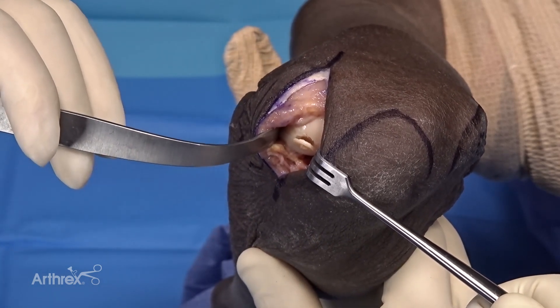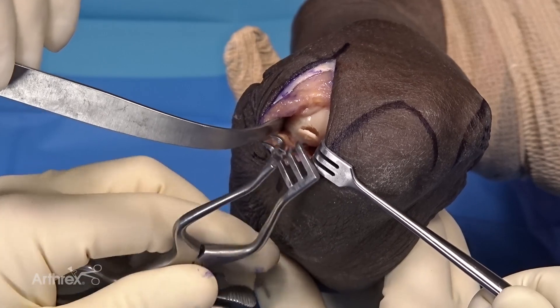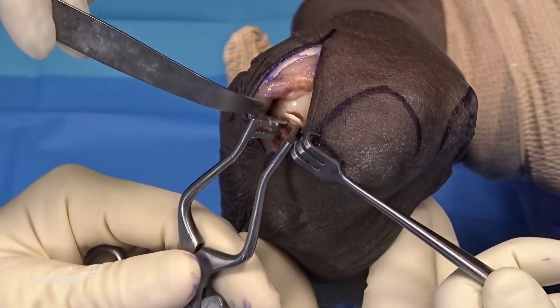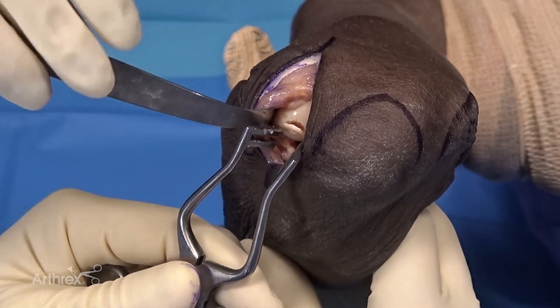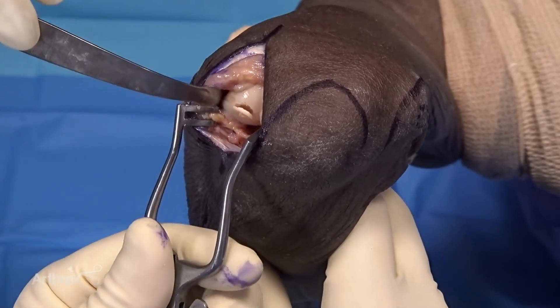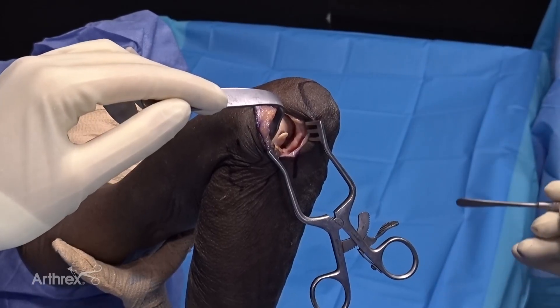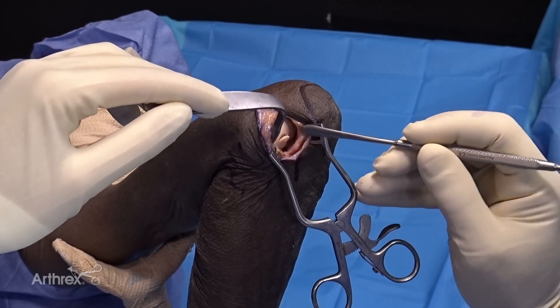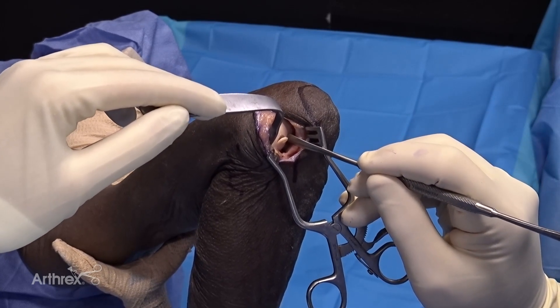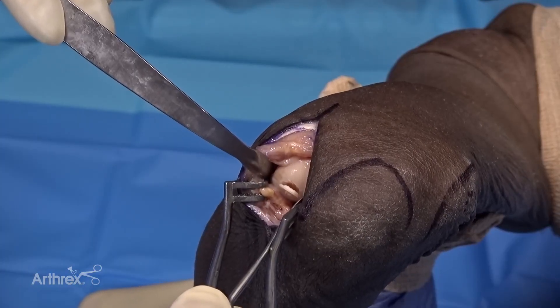The Hohmann retractor is placed around the lateral edge of the distal humerus. We can place a small self-retainer as well. Occasionally additional exposure and access to the more medial portion of the trochlea is necessary, depending upon the medial extent of the OCD.